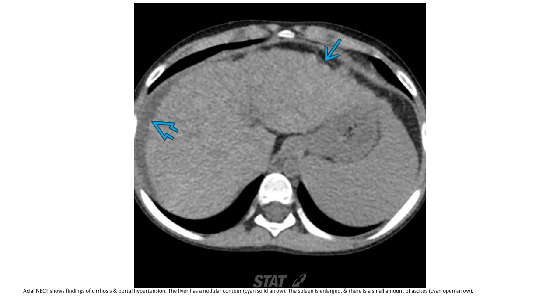On non-contrast CT, findings of cirrhosis include a nodular liver contour, enlarged spleen, and a small amount of ascites.